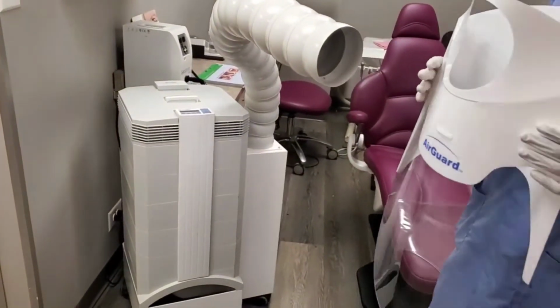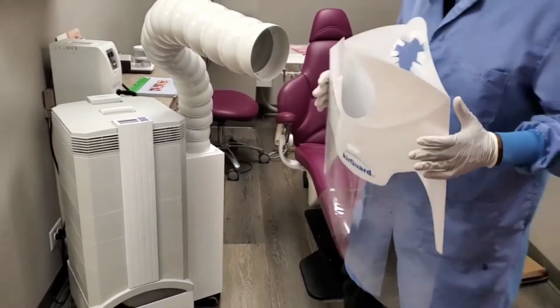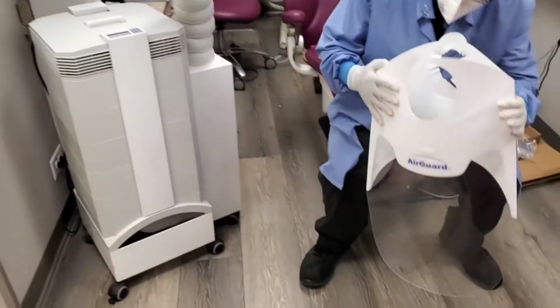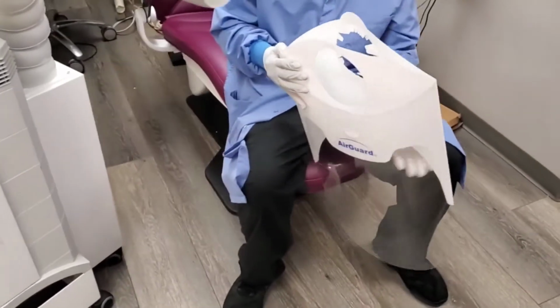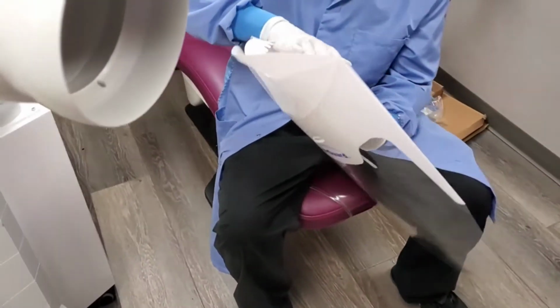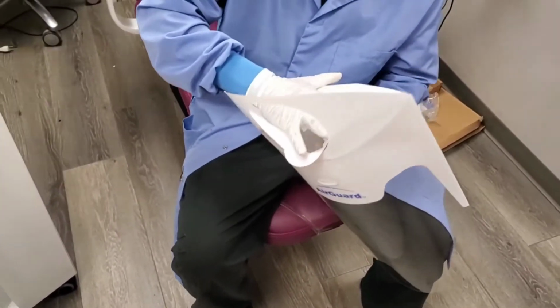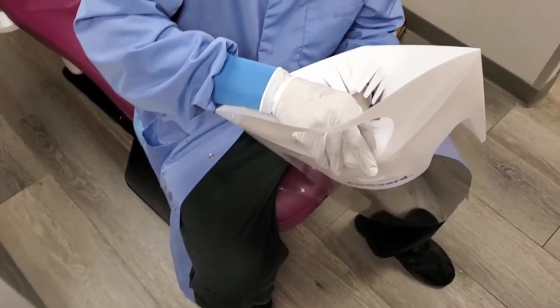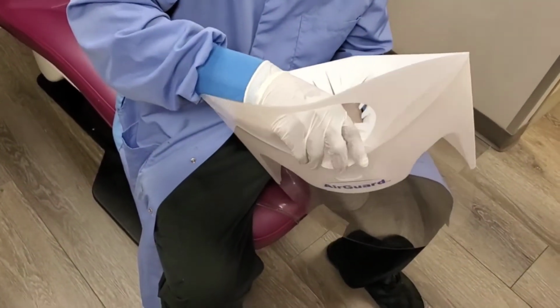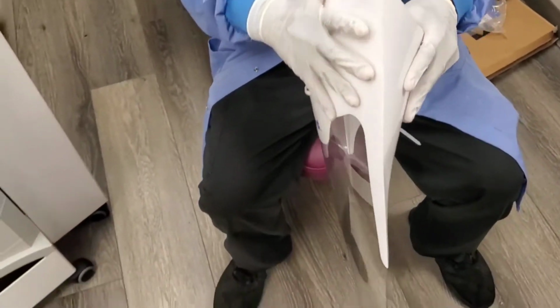So once again, you want to warm the plastic up. And I like always doing this sitting down. It gives me better control over it. So I put my hand on the inside over here and slowly bend this. As I'm bending it, I take my time. And then as I get in it, I'll put it in a hole right here. And after it's in the hole, then I close it down.